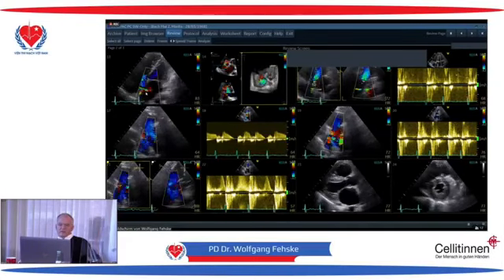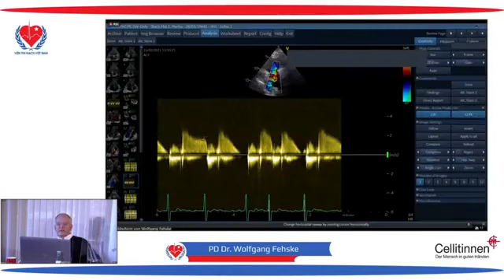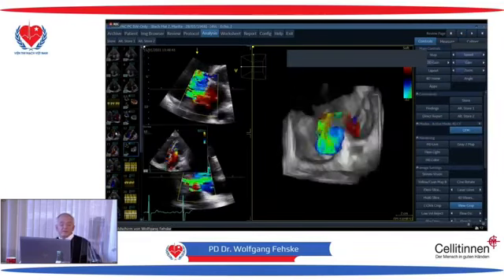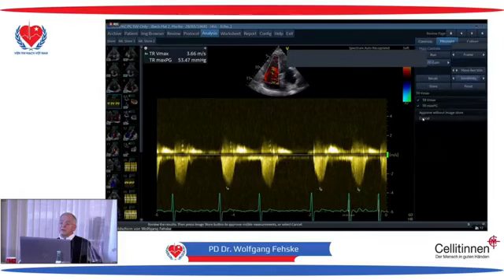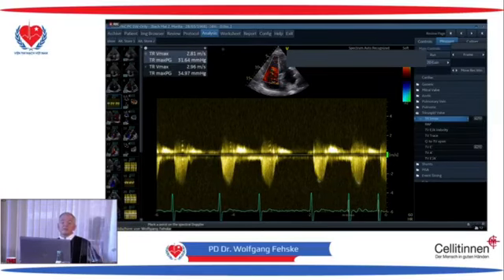But the patient recovers extremely well, but we must say that the pulmonary regurgitation, as it was before, is still high resistance, and looking at the pressure in the right ventricle over the tricuspid regurgitation, in the same projection, it has reduced already.